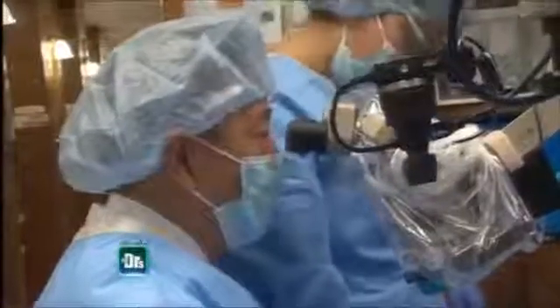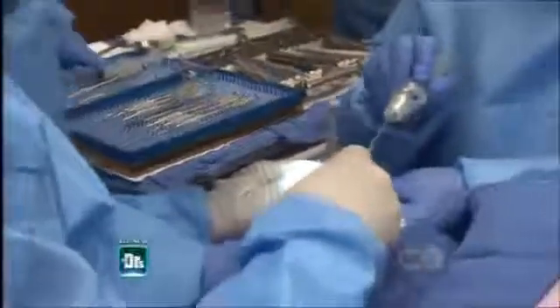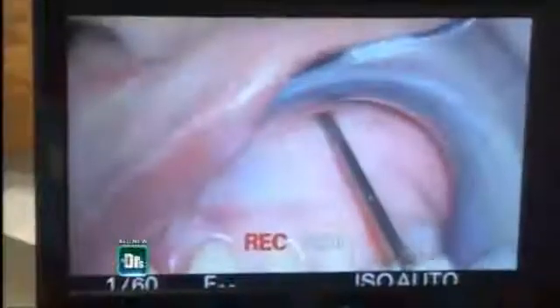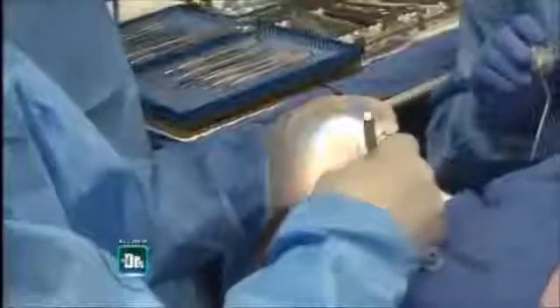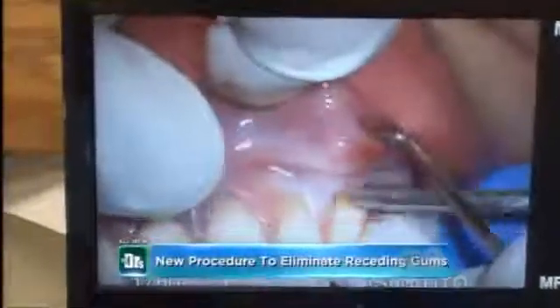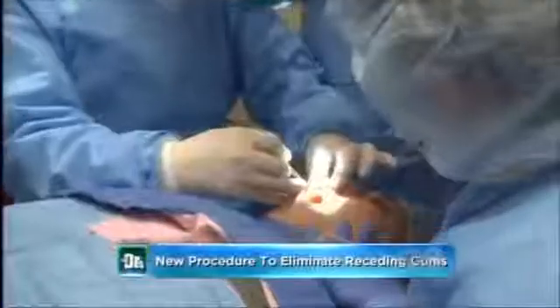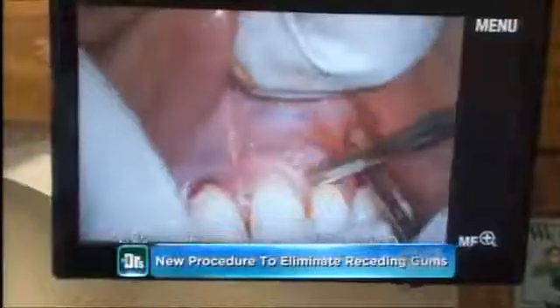It's going pretty quick. The pinhole will disappear in 24 hours. This is all one session, and I'm going to be done with the right side pretty soon. Now I'm going to put another pinhole right over the upper left cuspid, and we have about 3 more teeth to go. Now I'm moving towards the last 2 teeth. So far, I've used only 2 pinholes.